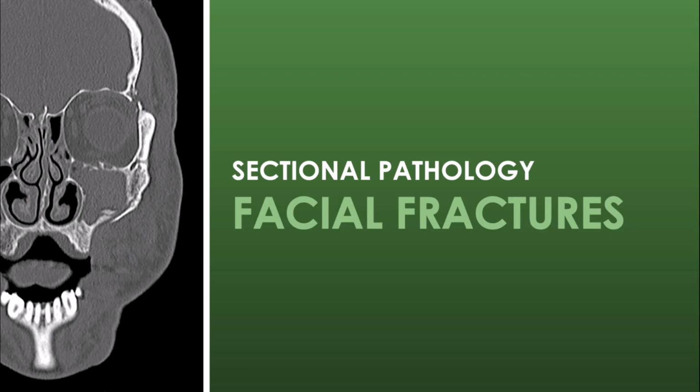Hey everybody, welcome back. This lesson is about the most common facial fractures observed in CT imaging. Any of the facial bones can be fractured in any number of ways, but some facial fractures are more common and some are given special names. That's the focus of this lesson.